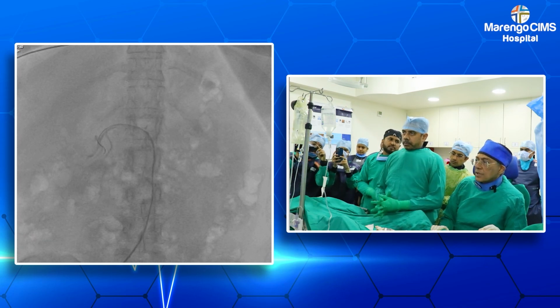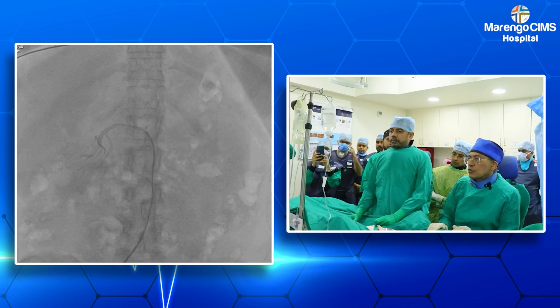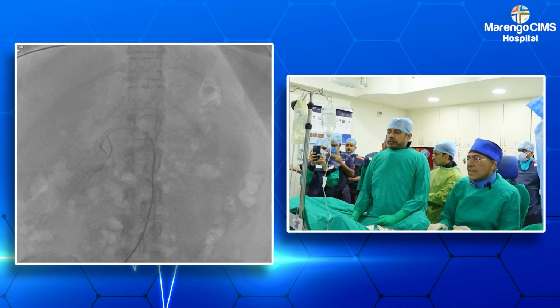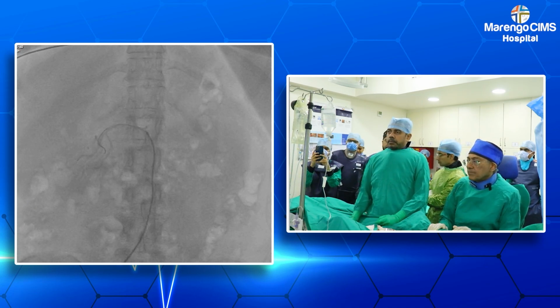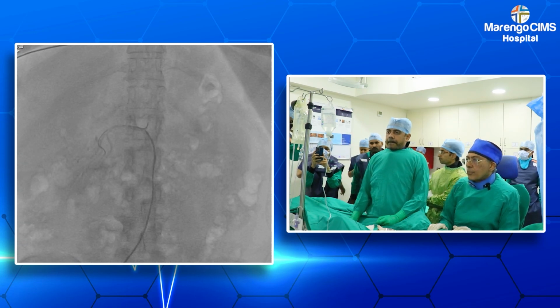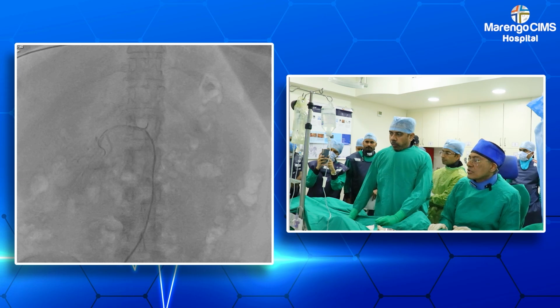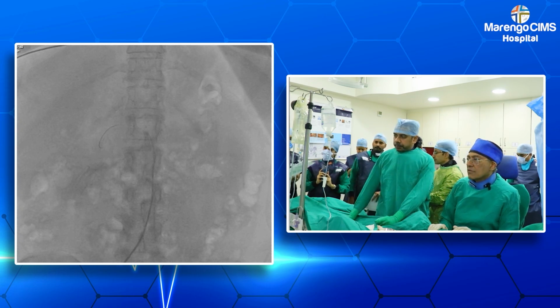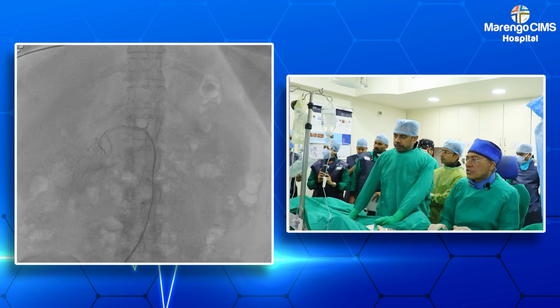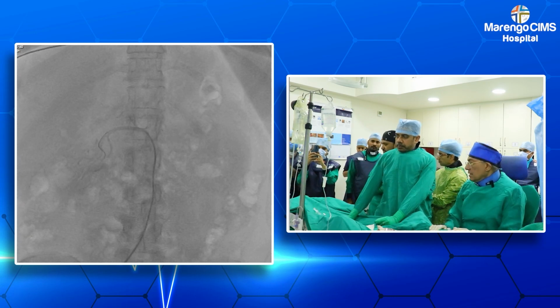I'll have Vipul Kapoor and Tejas Patel show you the catheter and how to straighten the catheter and backload the wire. We'll be using slightly stiffer 0.014 Grand Slam wire in this case. You can use conventional wires. However, conventional wires sometimes do not straighten the tip of the spiral catheter as well.